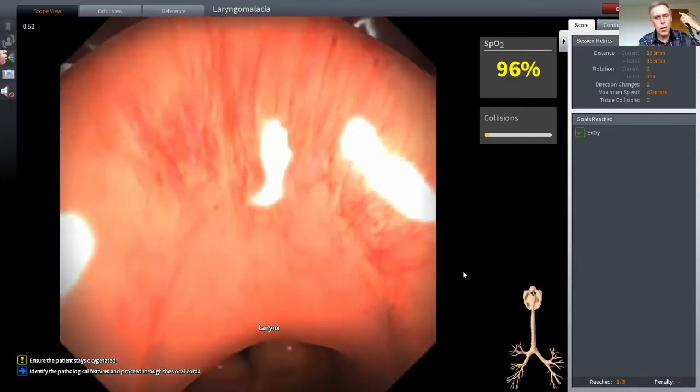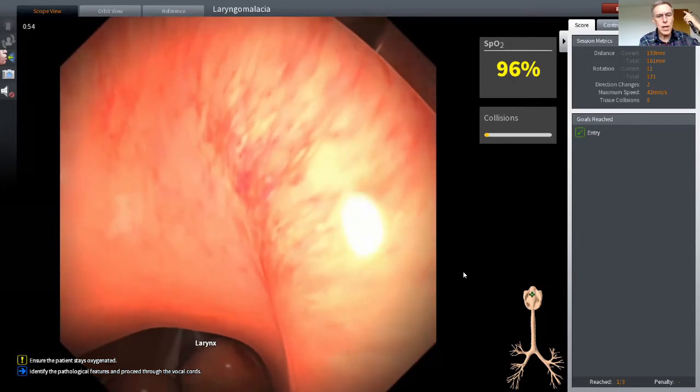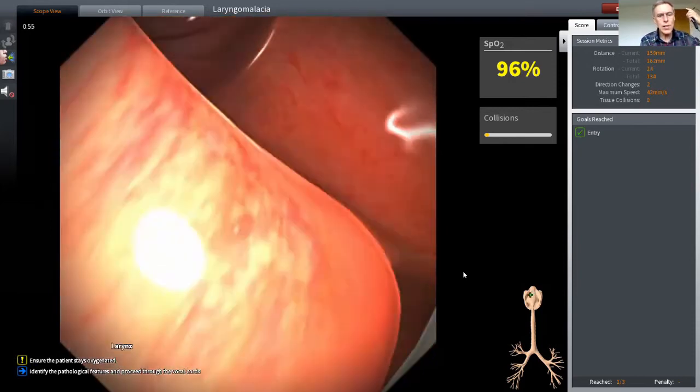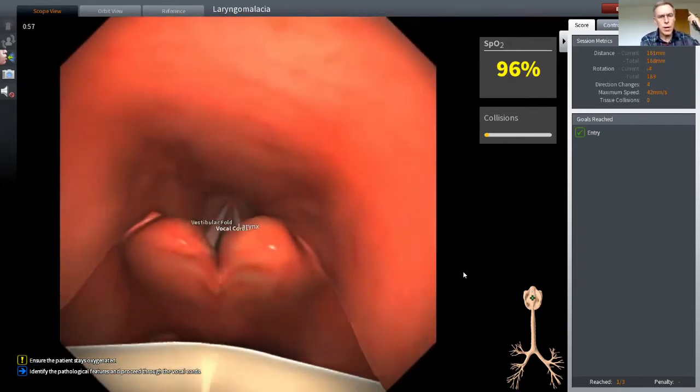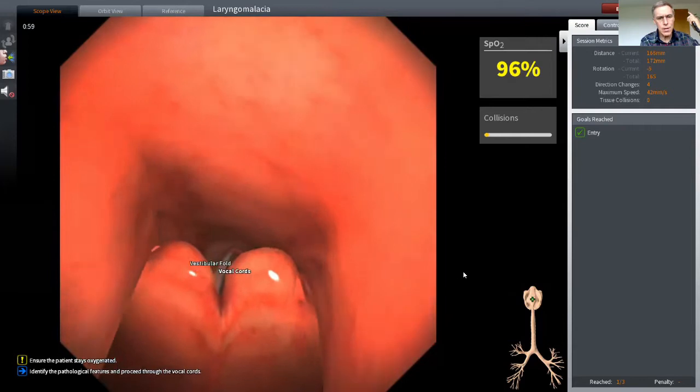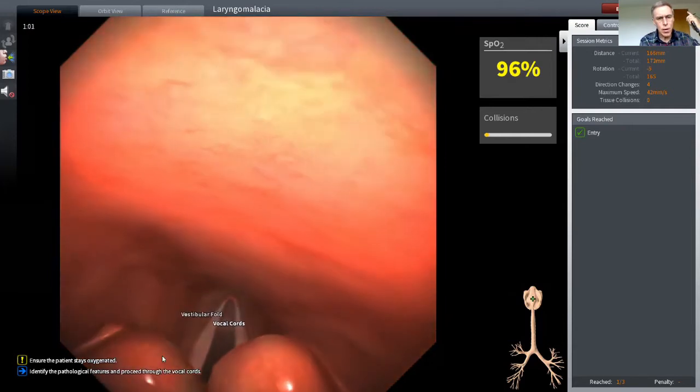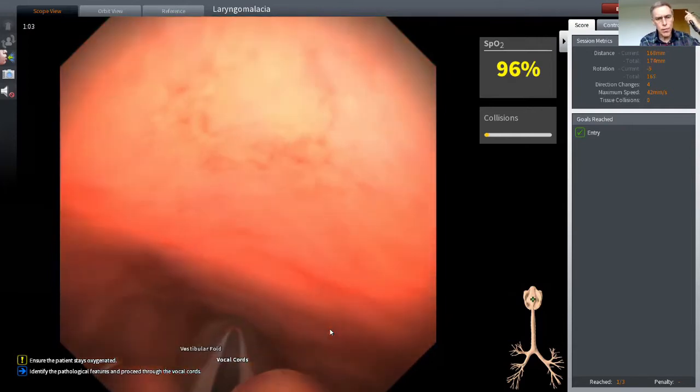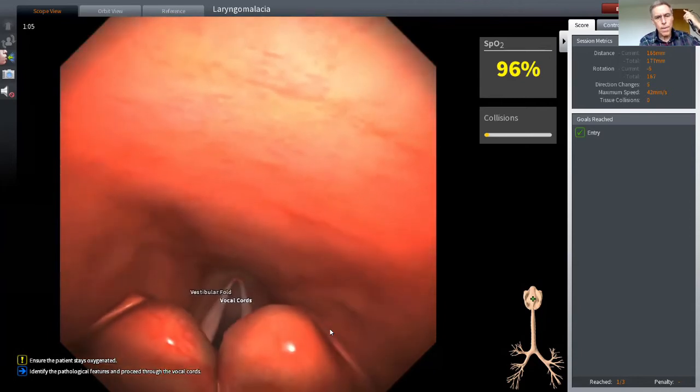When I go a little bit further, we can see the arytenoid cartilages. There are those two bulky cartilages looking at us there in the midline, and beyond that there's a bit of a glimpse of the vocal cords.